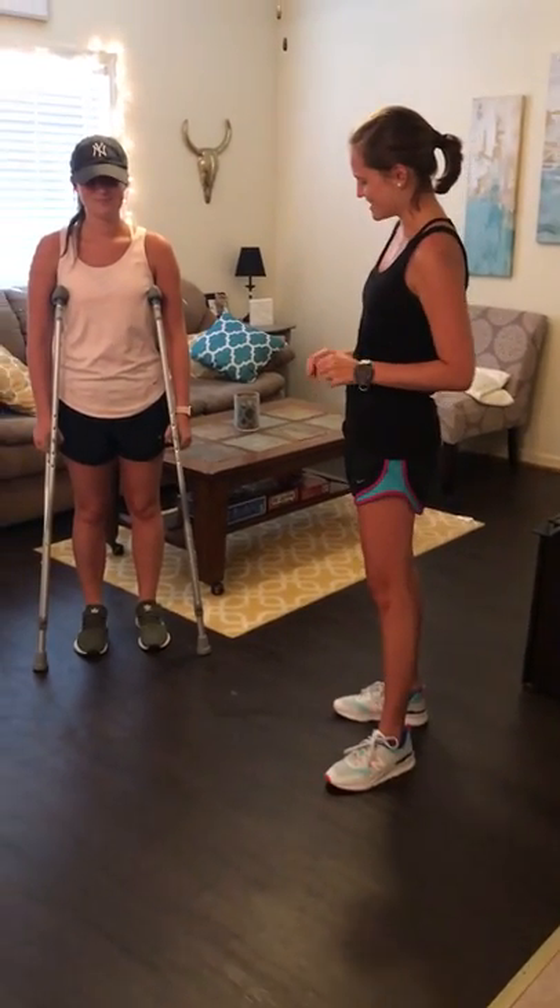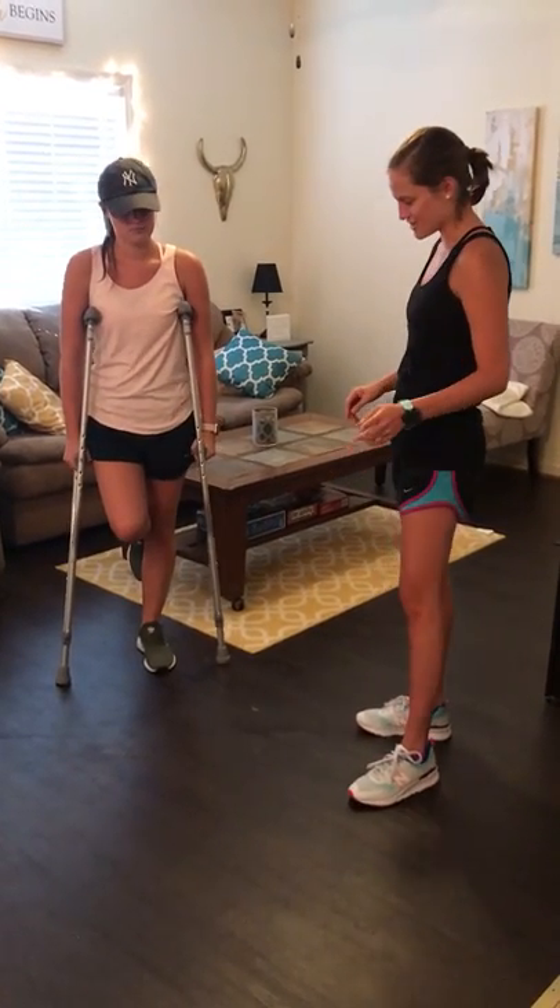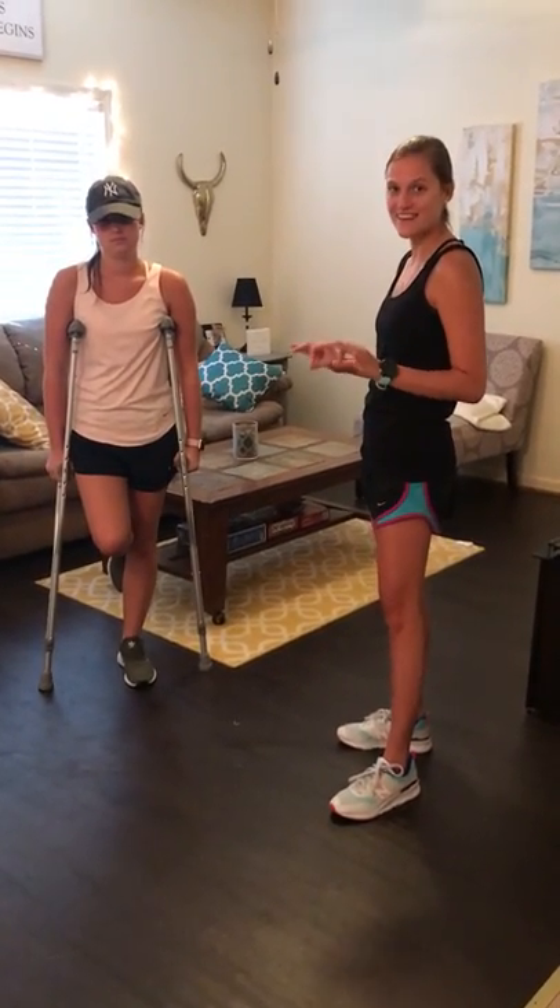We have a patient with a non-weight bearing right ankle injury, and first we're going to talk about how to walk on a level surface.